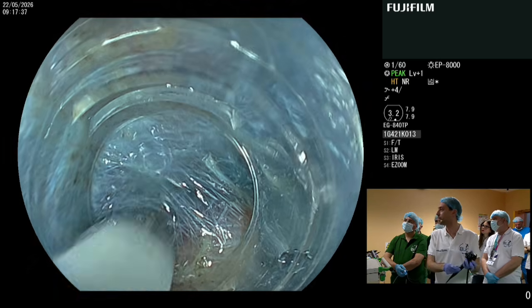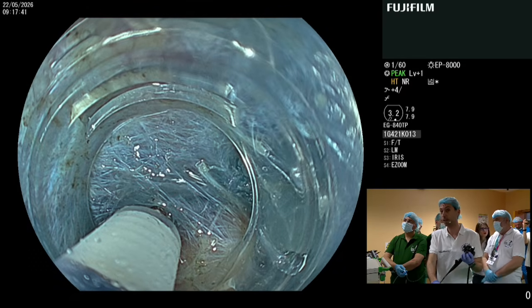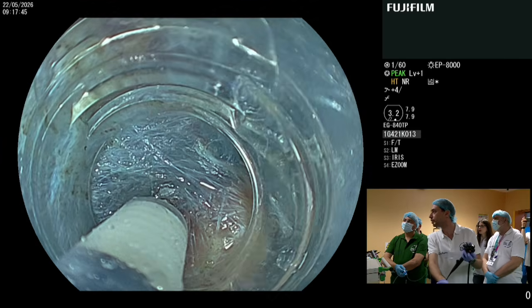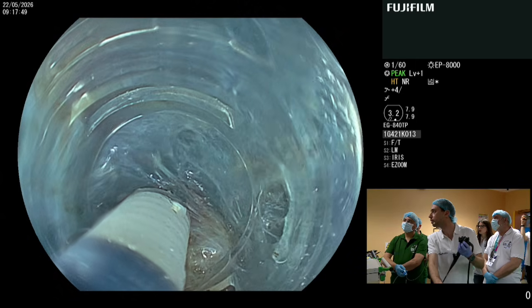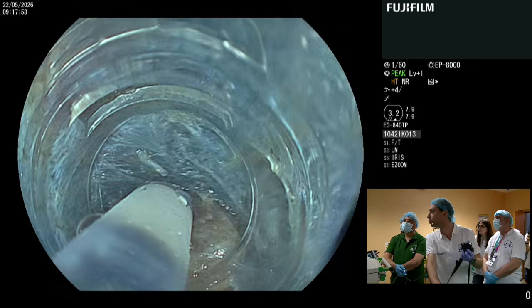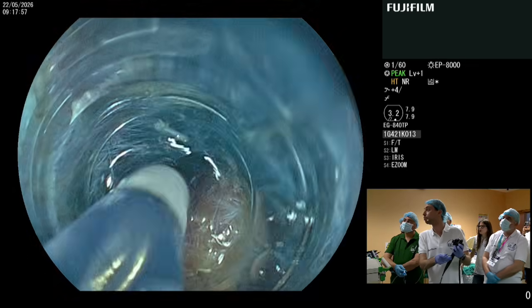I have to be very careful right now not to provoke mucosal injury. I will switch to endocut because endocut is more precise. The cutting is less efficient, but we have more precision.